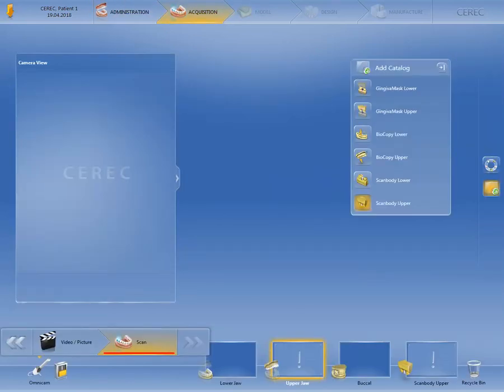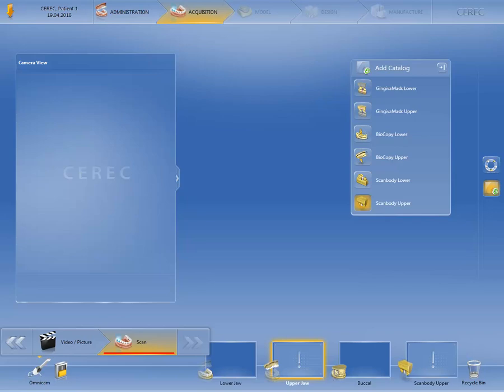In this phase, we will first take a look at the selection of image catalogs applying to our case, and then describe the remaining image catalogs, which can be added by clicking on the respective option. As we've selected the biogeneric individual design mode in the administration phase, four image catalogs appear at the lower edge of the screen.